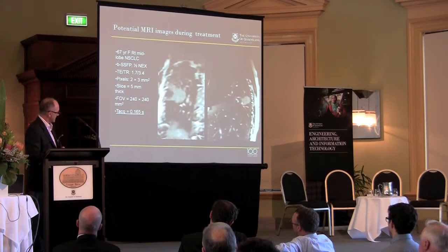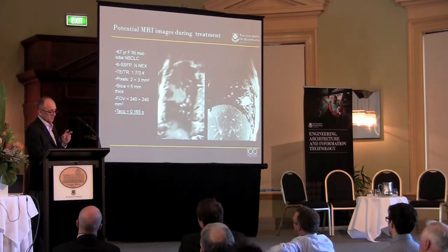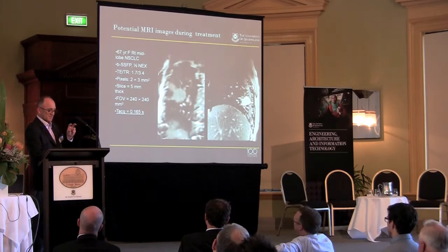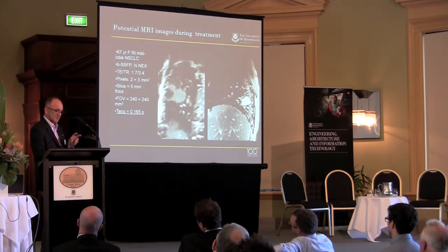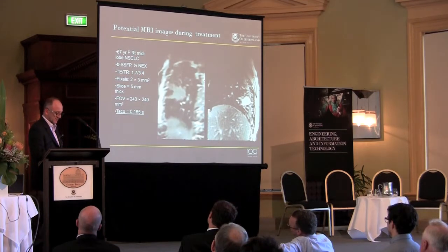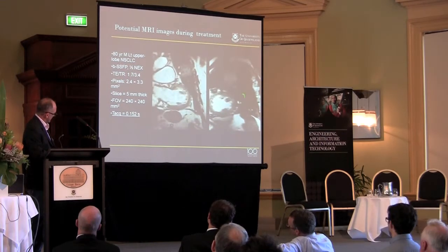So our plan is to change that and do image-guided therapy, where we have a radiation therapy device inside an MRI system. The MRI system finds the tumour, tracks it, and feeds that information back to the radiation beam, which then irradiates only the tumour, and irradiates it with a very high dose. Now, our clinical colleagues estimate that this will improve survival rates in lung cancers by as much as 25%, if we can get it to work the way that we plan, and reduce potential side effects by up to 75% in these patients. So that's our motivation over the next 5 years. We have enough funding to get about halfway at the moment, so we continue to search for funding for this project.